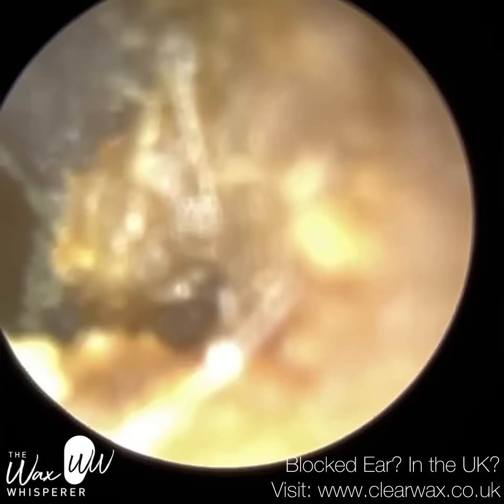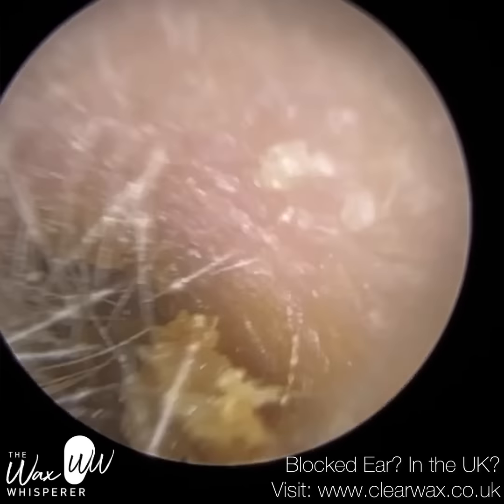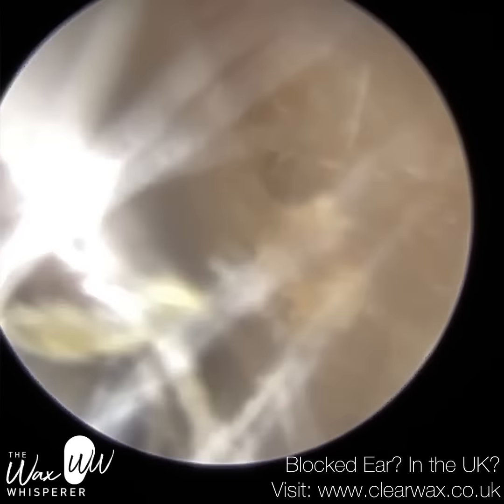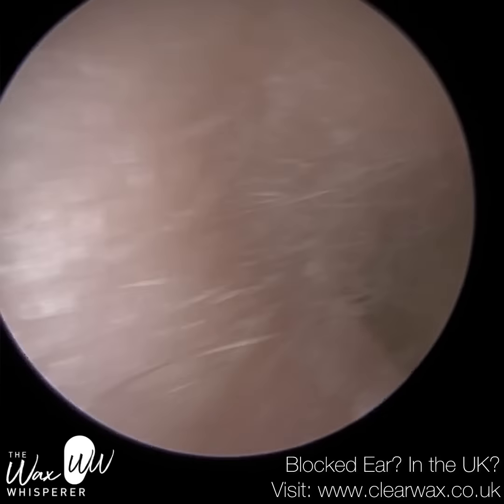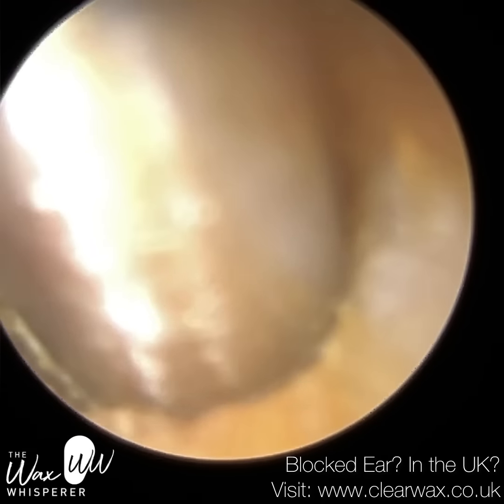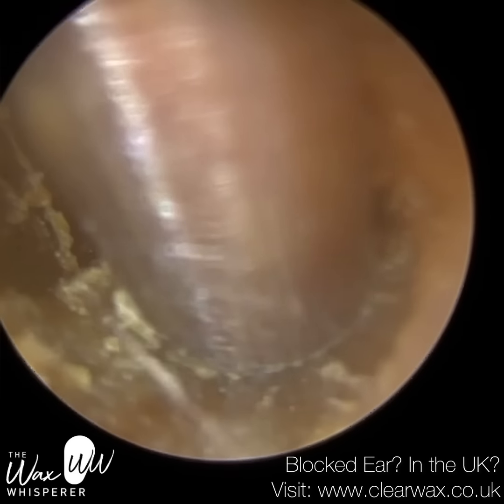So we're now just trying to use the right curette to remove some of this more lateral wax. It's got a very sticky, soft consistency. It's very hard to vacuum, so we will put some medical-grade olive oil spray on just to change the consistency. You can see it's all smeared, like thick butter, so obviously we're trying to lift it off the canal wall, but that can be difficult because it's smeared.